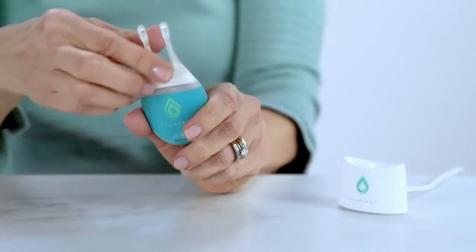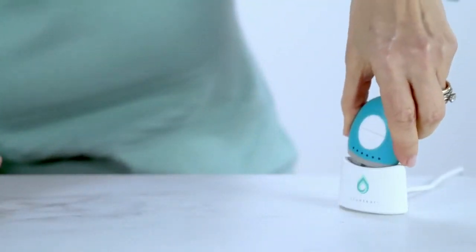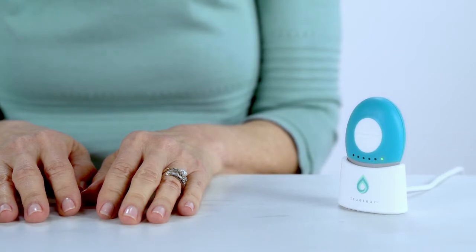Remove the tip by rocking it — the disposable tip should disconnect easily. Keep track of how many tips you have and be sure to refill them as needed. Charge your device overnight so it's ready to go when you are. It should take less than four hours for the base unit to reach a full charge, and a green light will appear when charging is complete.